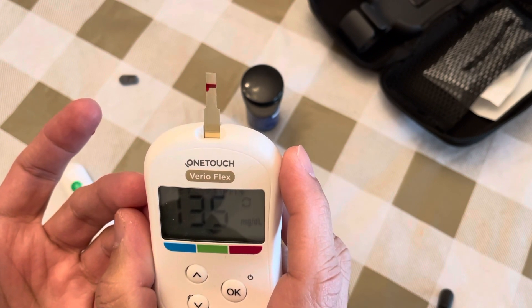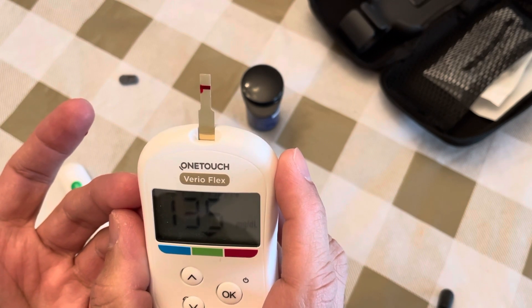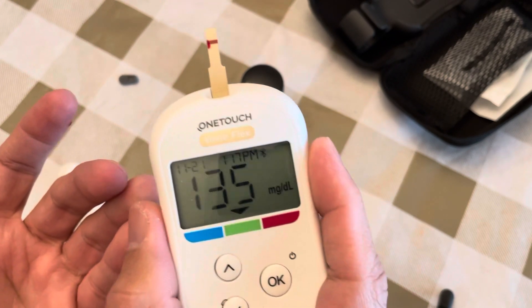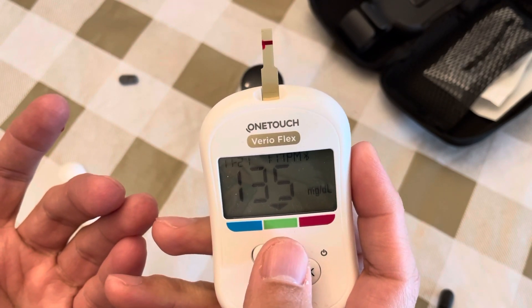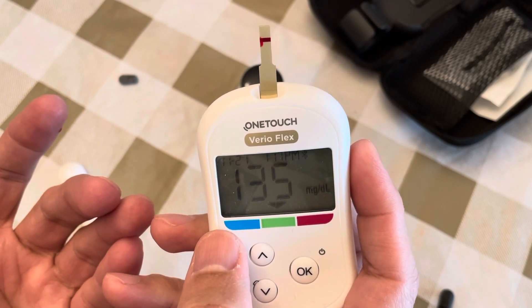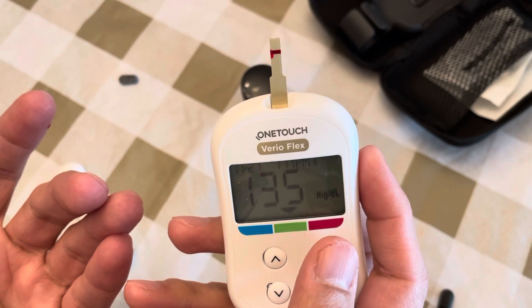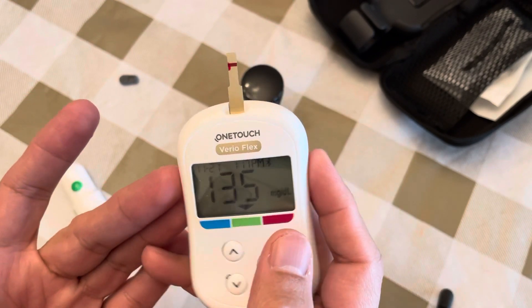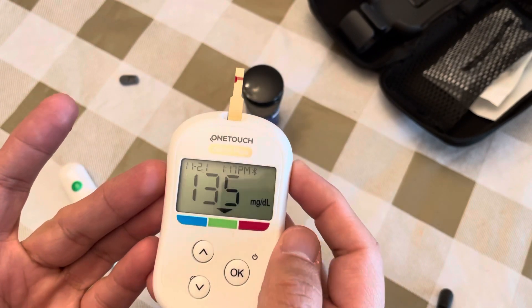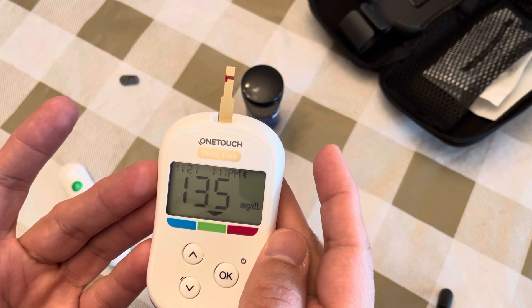In my case the reading is 135, which is about two and a half hours after breakfast. The result shows green, which means it's within range. Blue indicates low sugar and red indicates high sugar.